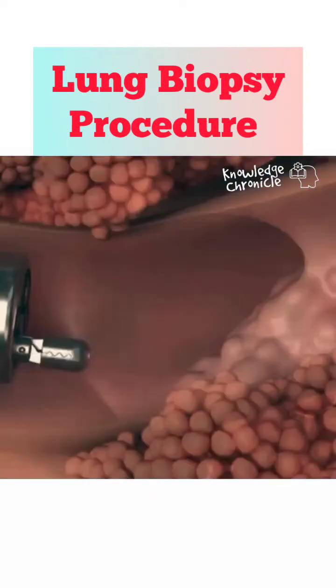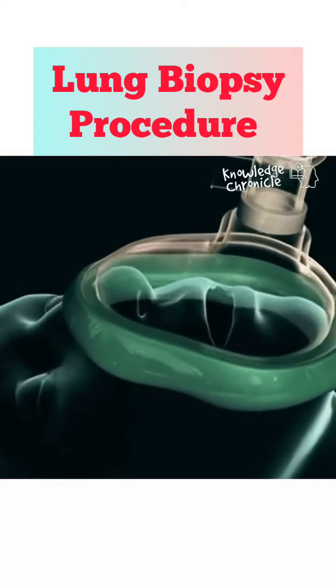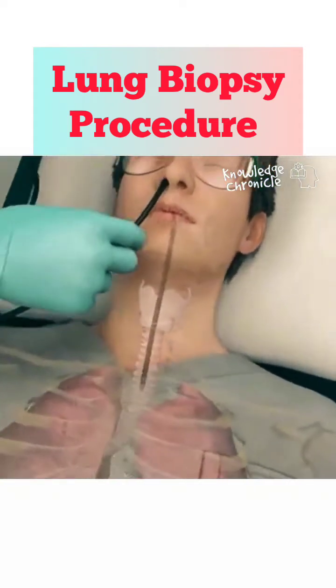Ever wonder how doctors perform lung biopsies? Here's how it's done. First, the patient is sedated through an intravenous to ensure comfort during the procedure. Local anesthesia is applied to the throat to numb the airway.